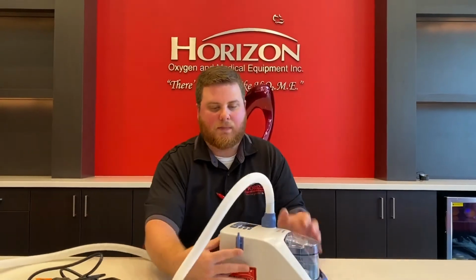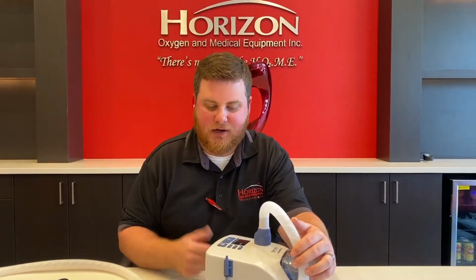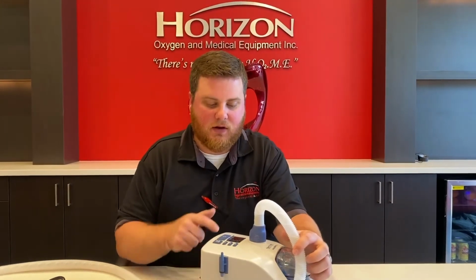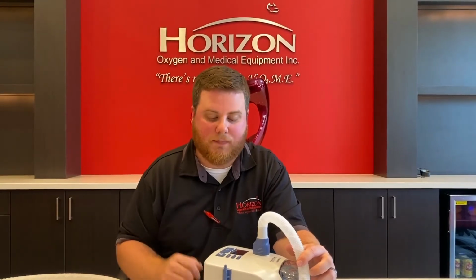When we're ready to start the machine, we're going to go to the power on and off button, which is right here. When we first turn the machine on, it'll tell you who the manufacturer is. In this case, it's Fisher & Paykel, and then it'll tell us the Airvo 2, and then it'll let us know the last disinfection date. If you ever see a red light there, it's time for this machine to be maintained. So it's important for you to let us know that, and we can swap this machine out.